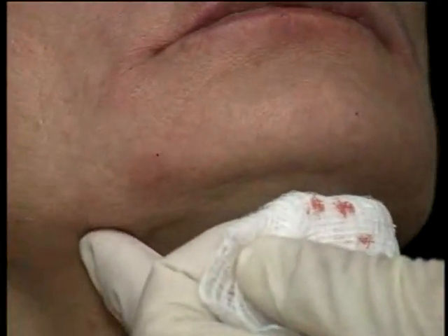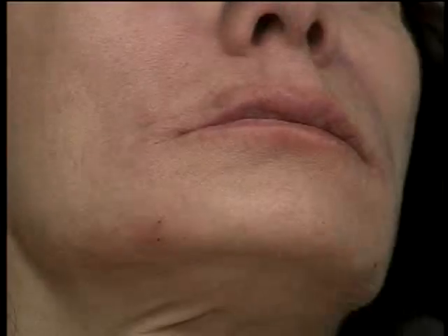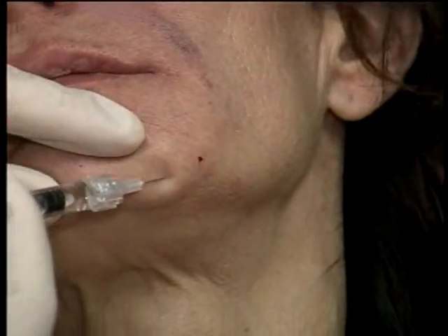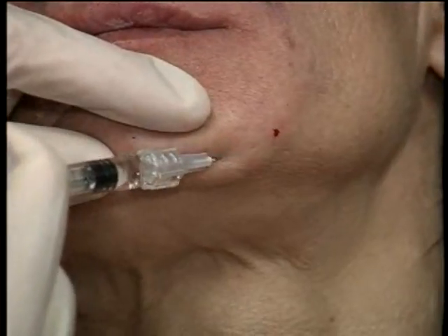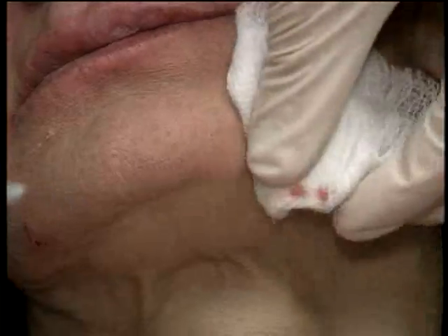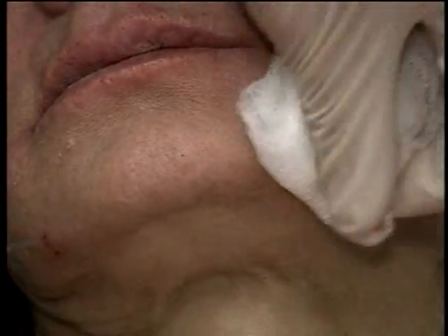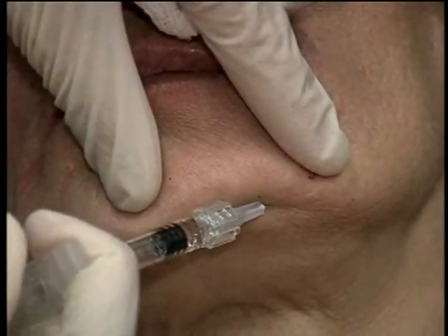Turn your head this way. Chin down. Making sure to stay medial to that pre-jowl sulcus. And then massaging it afterwards. And coming a little bit underneath the mandible.